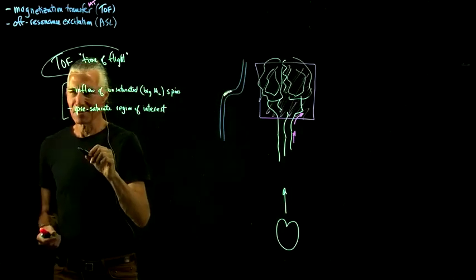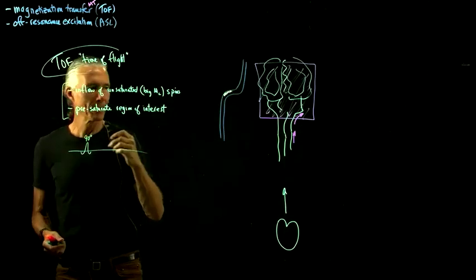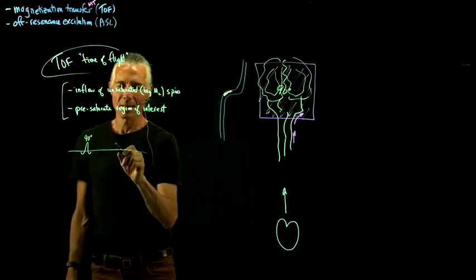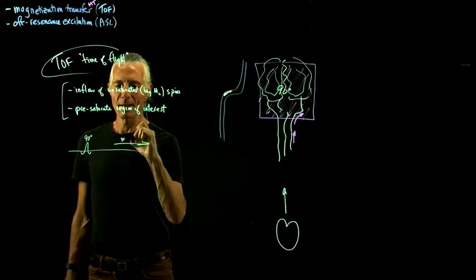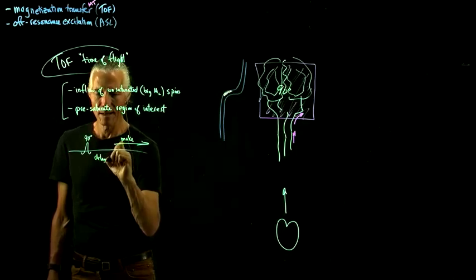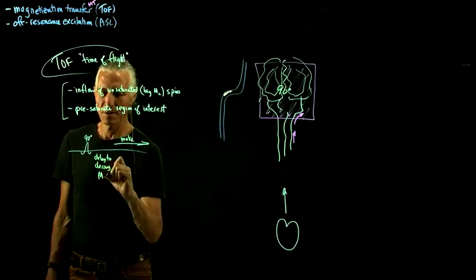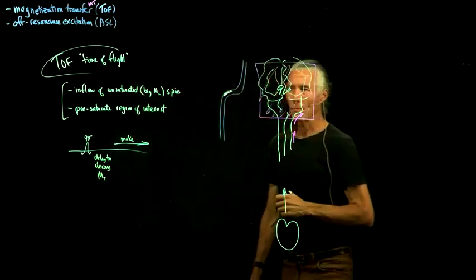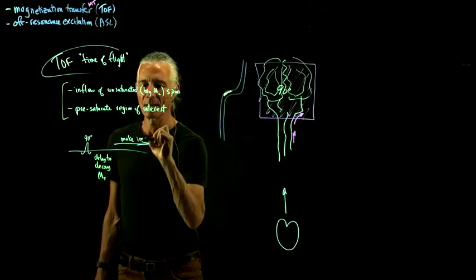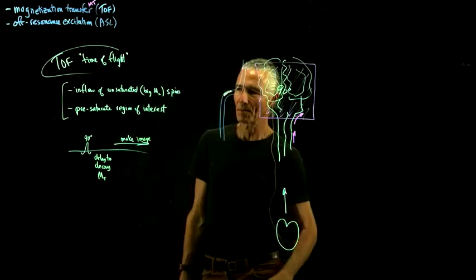Well, it's strangely just like every other pulse sequence. So do a 90, do a 90 up here. And then make an image. So give a little delay to decay MT. So we made some MT from that, and that would make a huge signal. So let it decay, then make the image. And what you'll see is basically just blood vessels. It just looks like these white blood vessels.